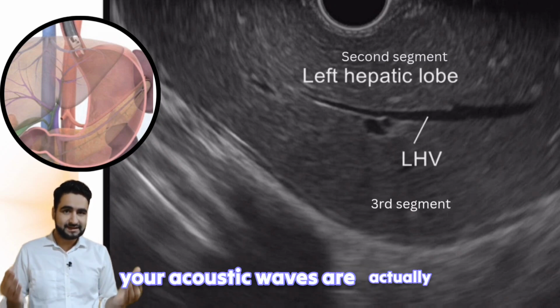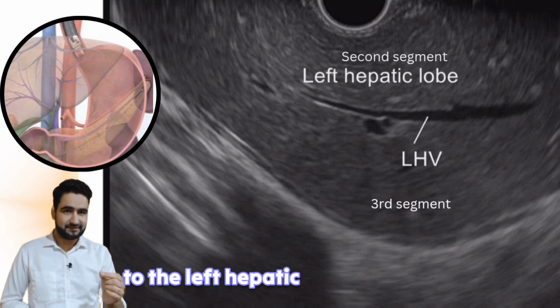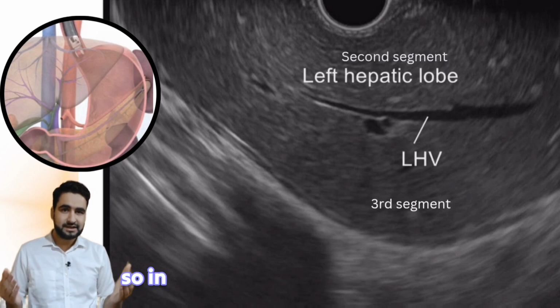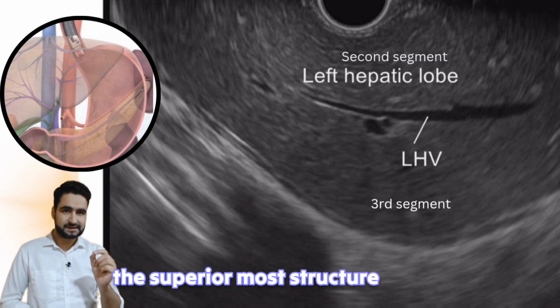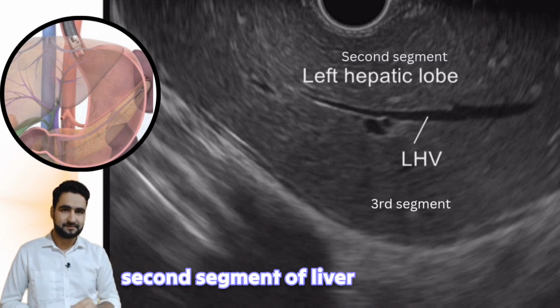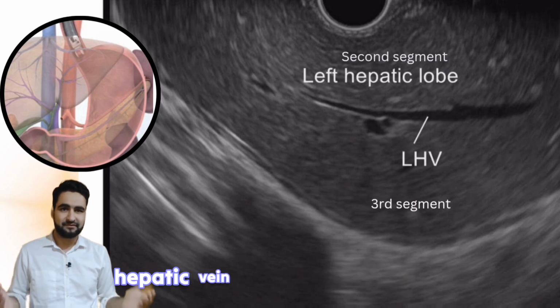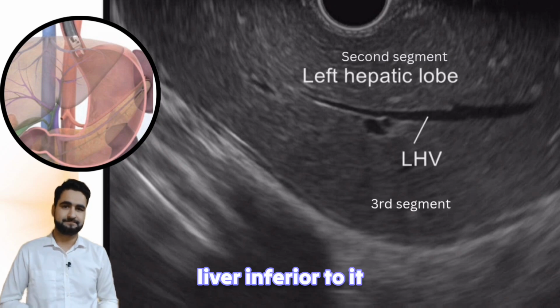So in this image, you can see while you start visualizing the left lobe of liver, your acoustic waves are actually traversing second segment of liver to the left hepatic vein followed by the third segment. So in your EUS image, you can see the superior most structure will be second segment of liver, and just inferior to it you can find left hepatic vein and third segment of liver inferior to it.